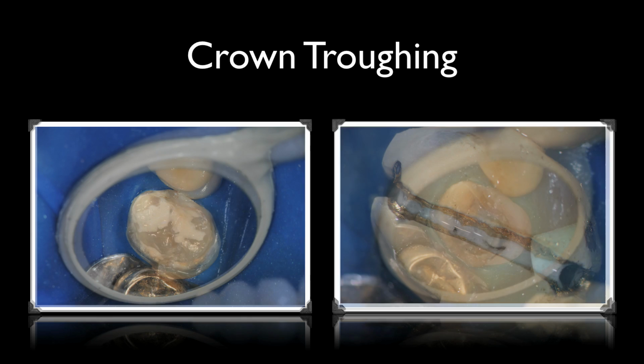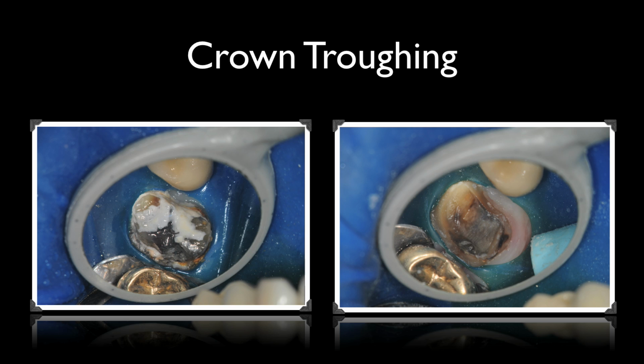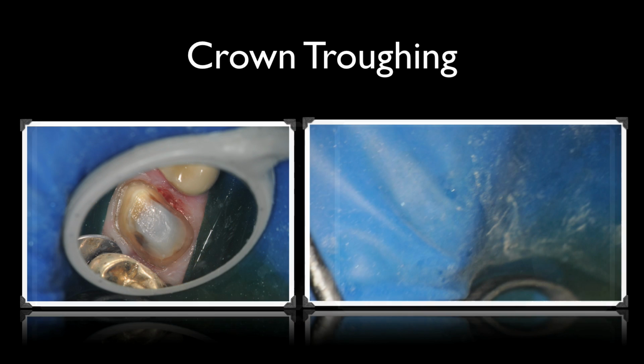This is pried apart, and after removal you can see the core of the tooth is fairly dark in coloration, and these are the ones that used to be of quite a concern until with high magnification you get a little bit better view of where there is decay, which was in this case on the distal and also on the lingual, as you can see on the right hand side. Now the tooth was cleaned up, prepared with a diamond, and then air abrasion was used, and we put a core buildup in the tooth, and you can see on the left hand side here core buildup.